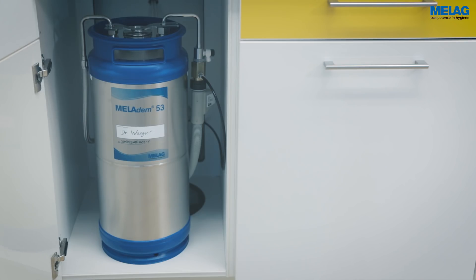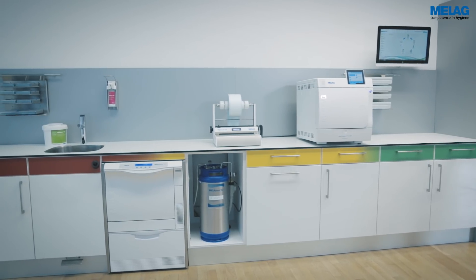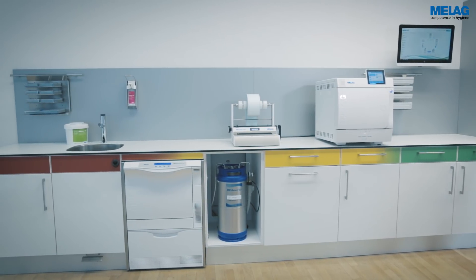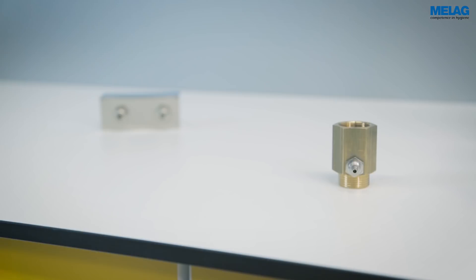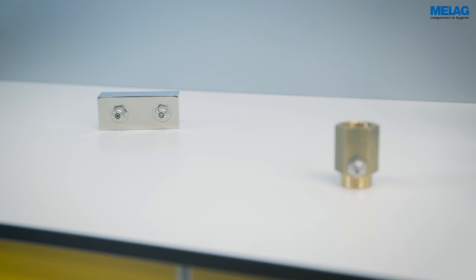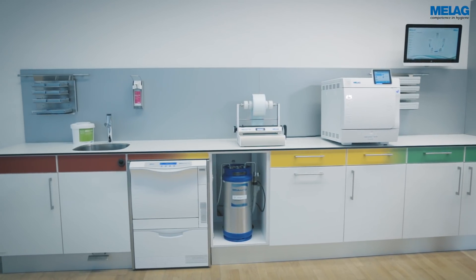The optional water treatment unit, MELAdem 53, performs the important final rinse of the MELAtherm 10 with demineralized water for the protection and care of your instruments. An additional water distributor ensures the efficient supply of demineralized water to further devices in the decontamination process.